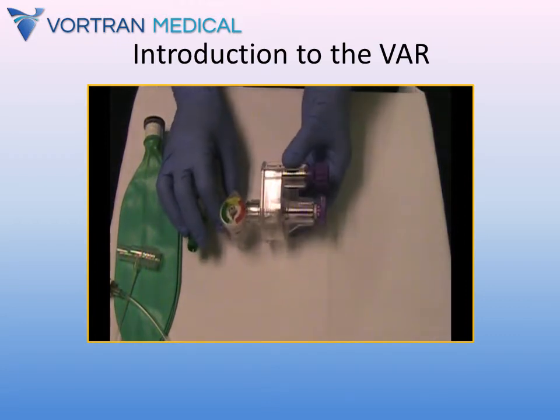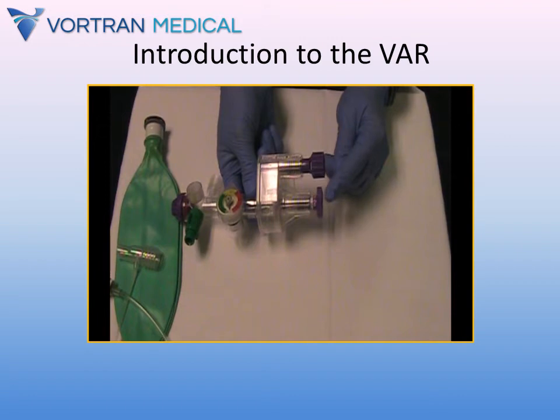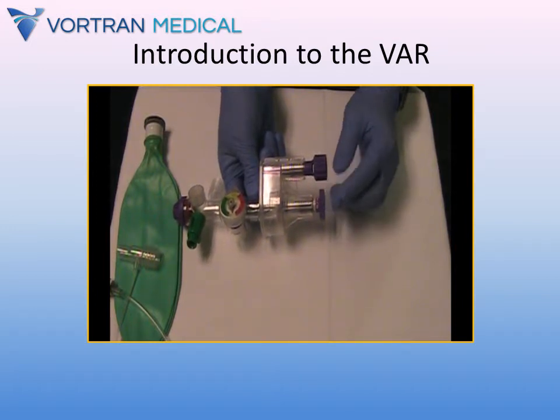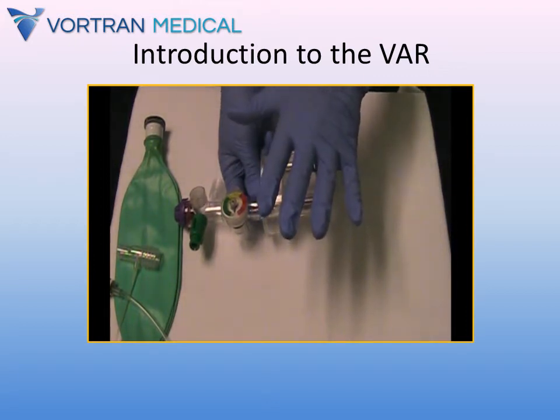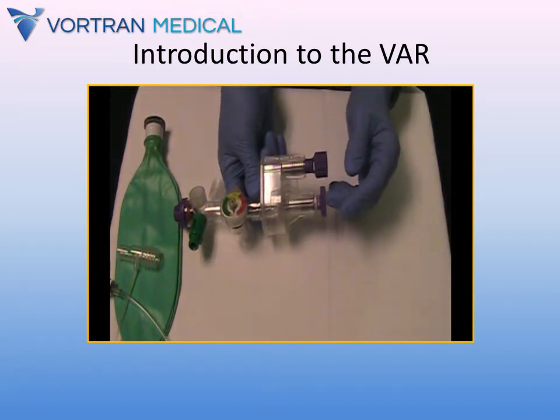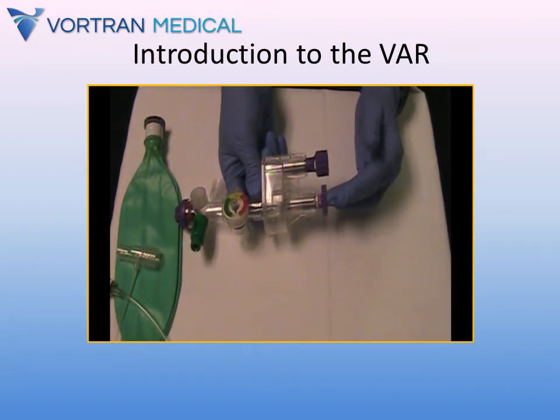The next valve here is shaped like a T. You can remember that because that is going to control your tidal volume, and the way it does that is this valve sets your peak inspiratory pressure. So the greater pressure you want in the airway, the more volume you're going to have to push into the lung. The more volume you push into the lung, the greater the tidal volume. So that's why we call that the tidal volume knob. It actually sets the peak inspiratory pressure, and as a result will also alter your tidal volume.